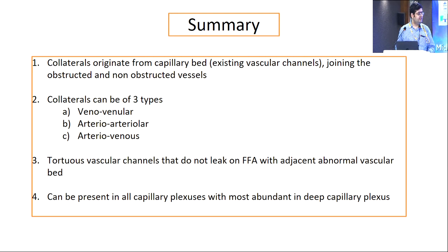So an OCTA will help us prognosticate these patients, and probably this patient went on to undergo a laser to an avascular retina away from the collaterals, just not to decompensate the superior half also. Thank you.